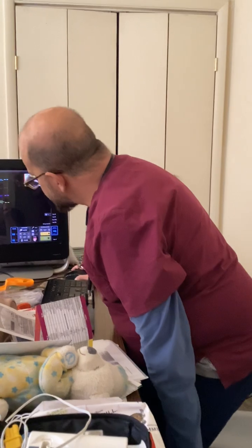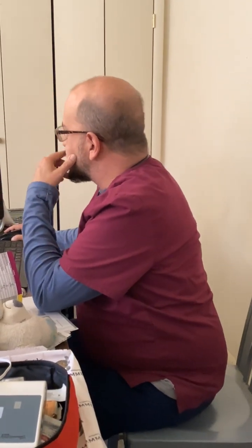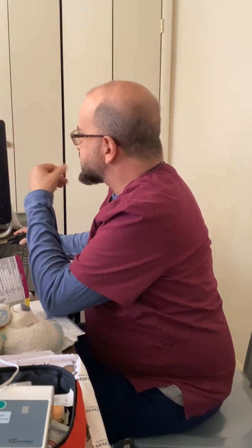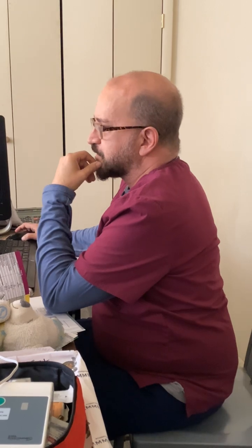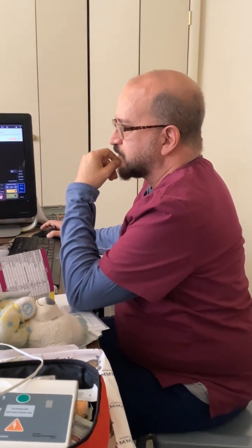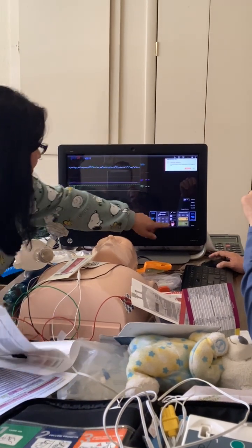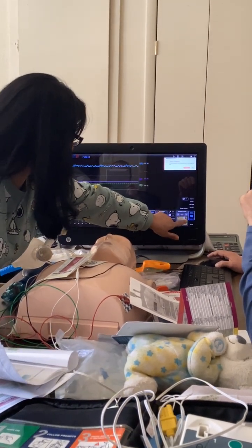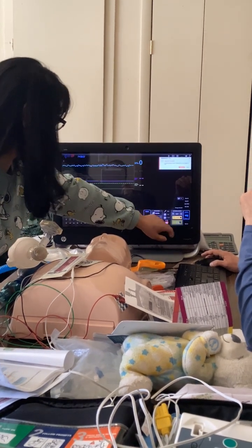So it's been a couple of minutes, they're intubated, good capnography, and then I stopped CPR, they're still in VFib. Yes. So it's time to shock again. You're right. Okay, so you can stick to that. Okay. Charge. Clear. Everybody clear? Clear. Charge.